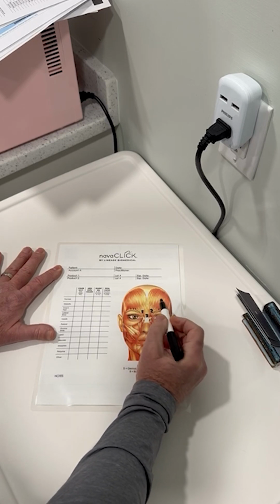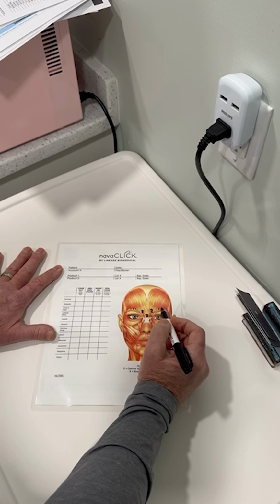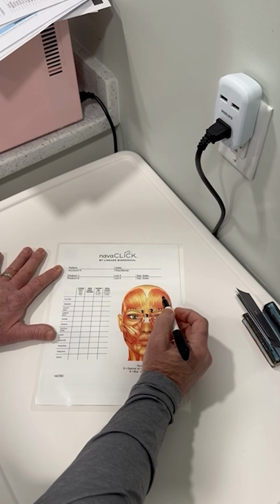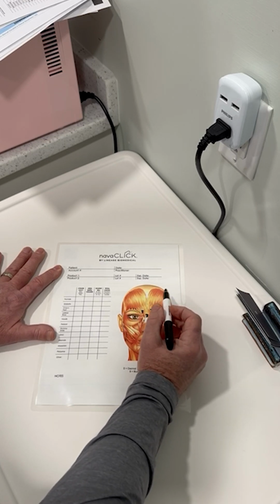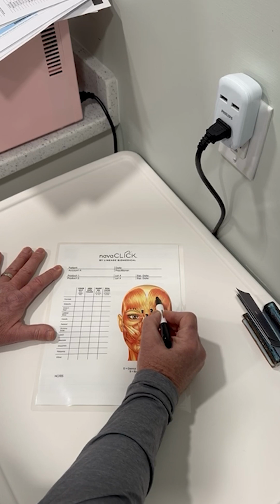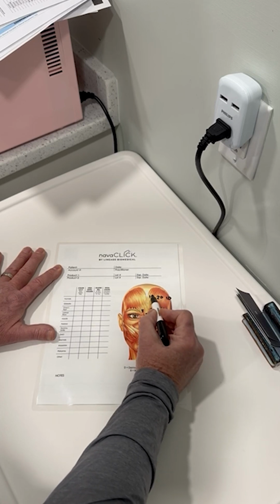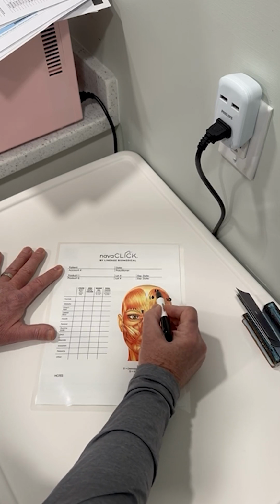So my forehead, I know, and my patient told me that they get heavy brow if they paralyze the forehead too much. So in that situation, I'm going to accept the fact that I'm going to have some movement, and I'll tell the patient that. And I'm going to put 2 in the dermis here, 1 in the dermis, 1 in the dermis, 1 in the dermis.